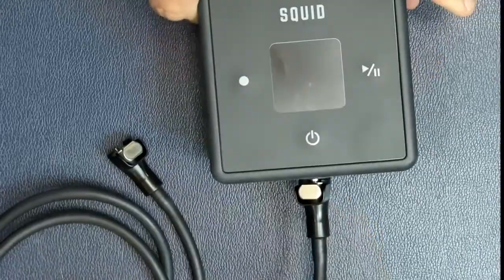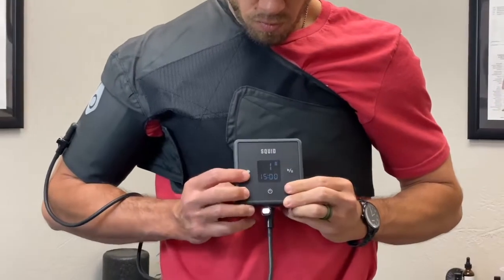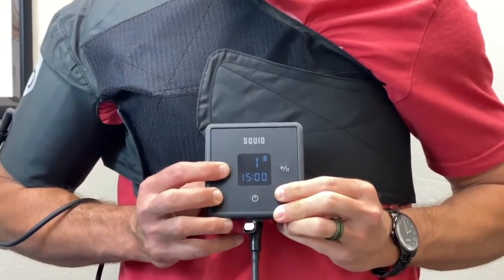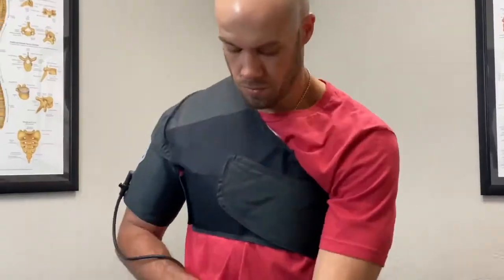Attach the connector tube to the pump and wrap. Turn on the Squid Go control unit. Select compression level with the white dot. Start treatment by a long press on the start button. Full treatments last 15 minutes. You can see the treatment progression on the display. The unit will turn off automatically at the end of the treatment.